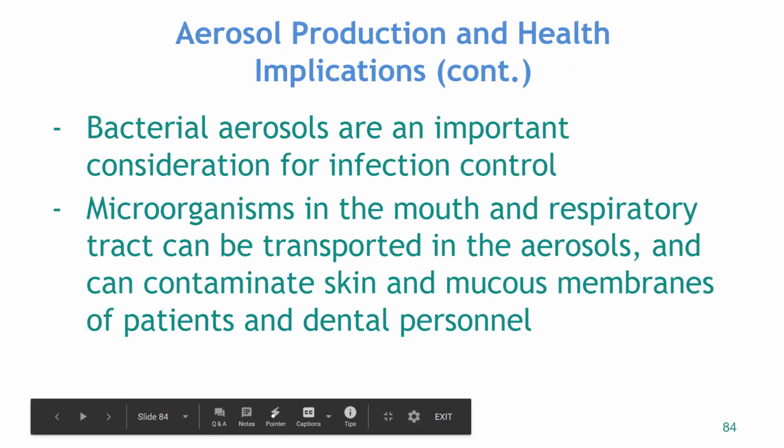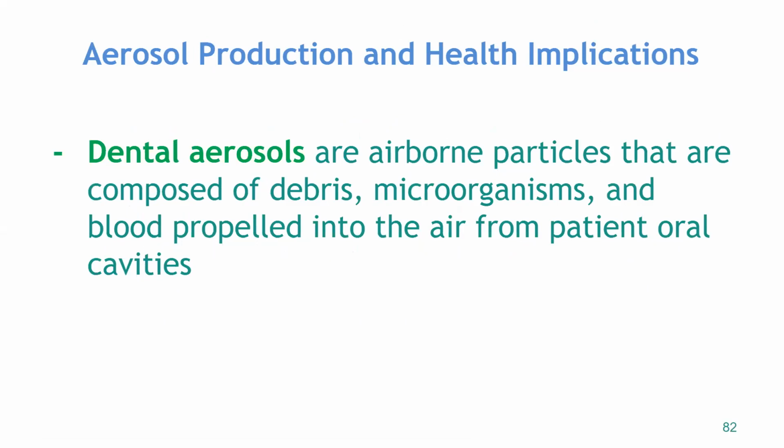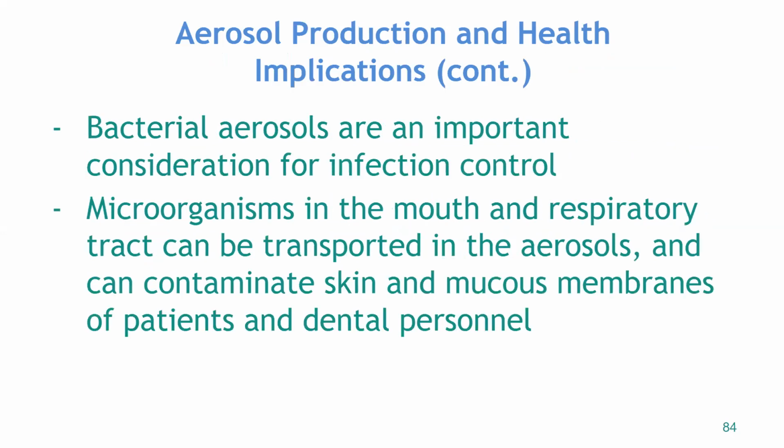Aerosols are airborne particles that are composed of debris, microorganisms, and blood propelled into the air from patient oral cavities. Aerosols can remain suspended in the air for many hours, meaning your morning patient could pick something up from your afternoon patient if you're not managing your aerosols correctly. Ultrasonic instruments, dental handpieces, and air polishers are the greatest producers of aerosol contamination. Bacterial aerosols are an important consideration for infection control. Also, viral aerosols are important for infection control.